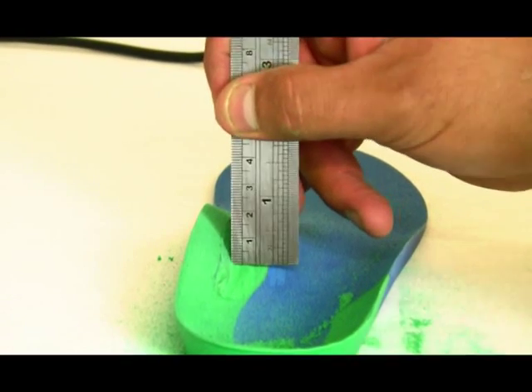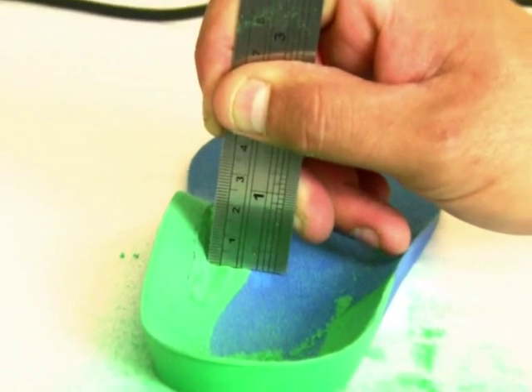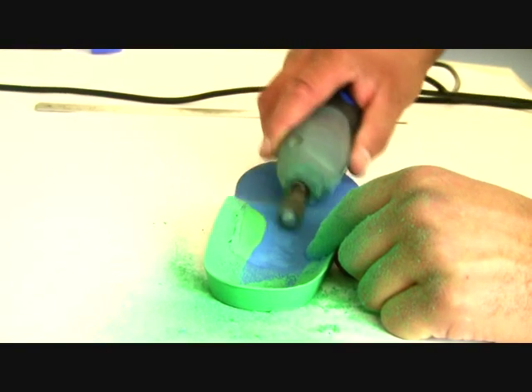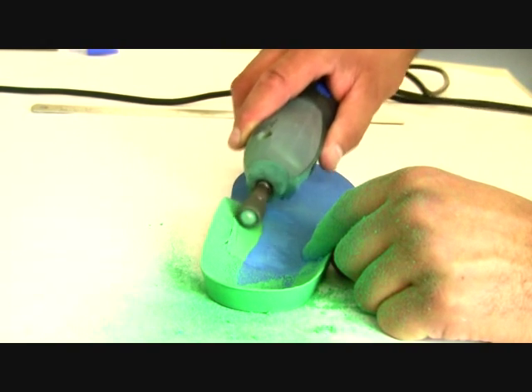Once you have done this, you need to blend the drop off into the rest of the orthotic so it will be comfortable for the patient. You can see the technician tidying up the groove and blending it into the orthotic.